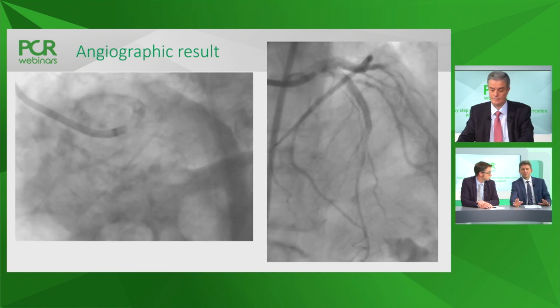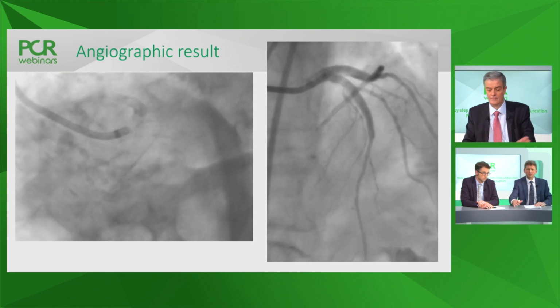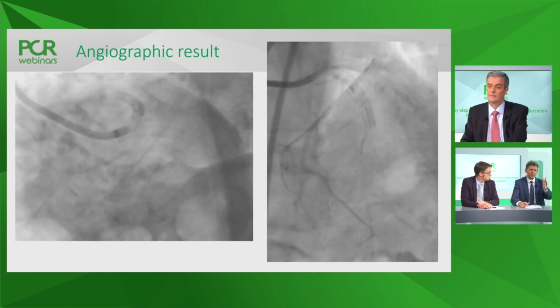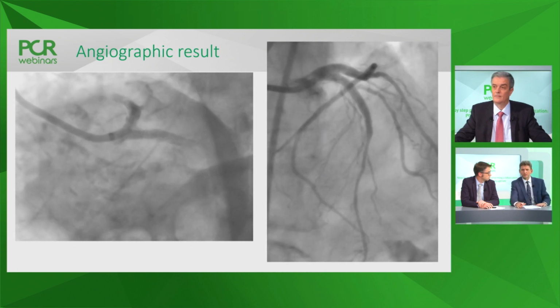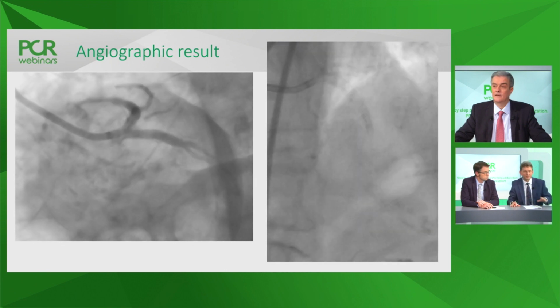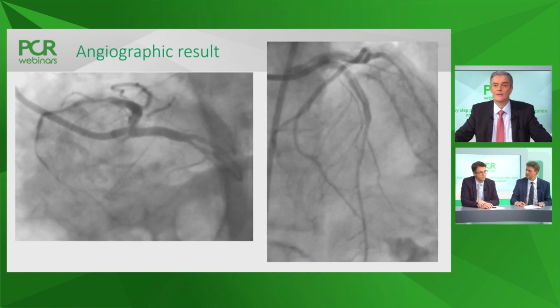Of course, although I think that here it's not the case, we know the minimal luminal area we have to obtain to ensure a good long-term result. So you should be at least 8 millimeters square in the left main, 7 at the bifurcation in the polygon of confluence, 6 in the proximal LAD, and if you stented, 5 in the circ. I'm pretty sure those MLA requirements are fulfilled here, but definitely I would recommend using IVUS in this situation. Okay. Yeah, show us the IVUS.